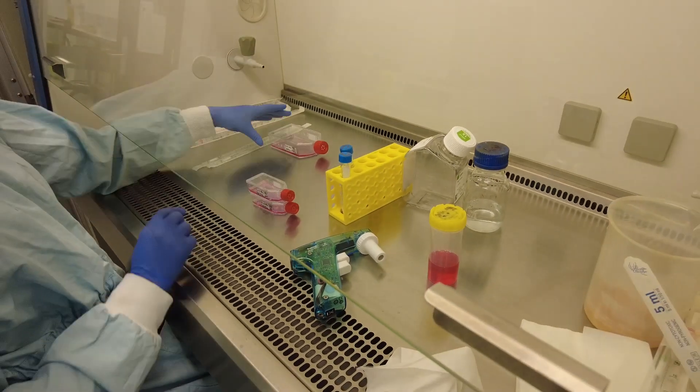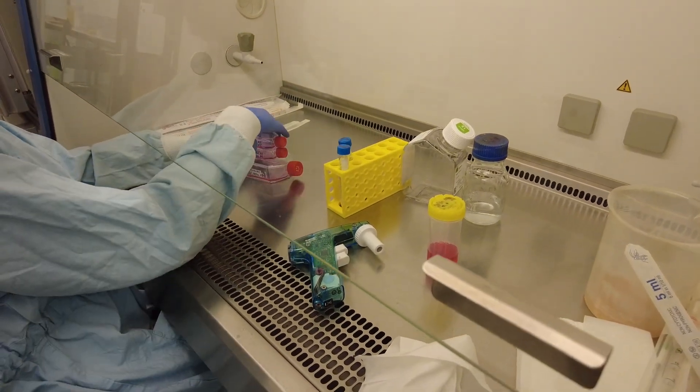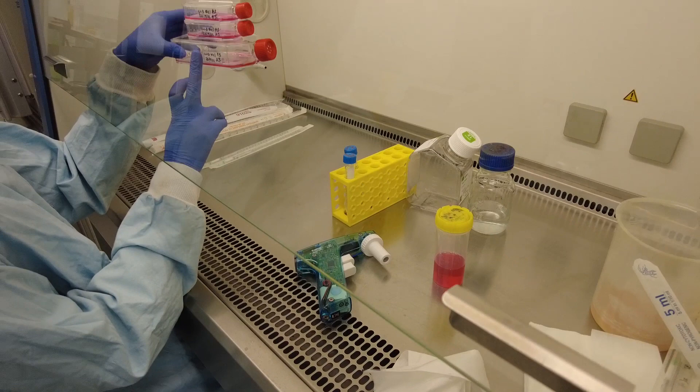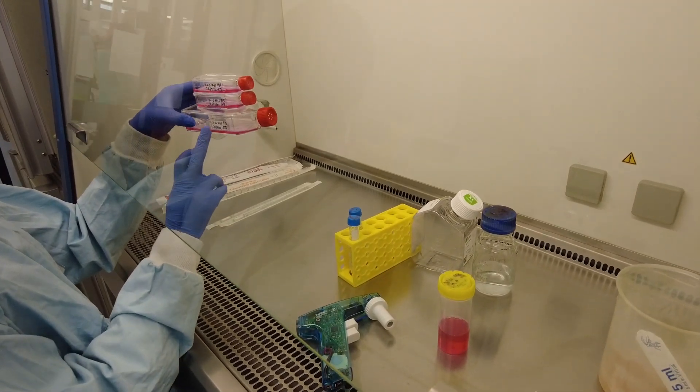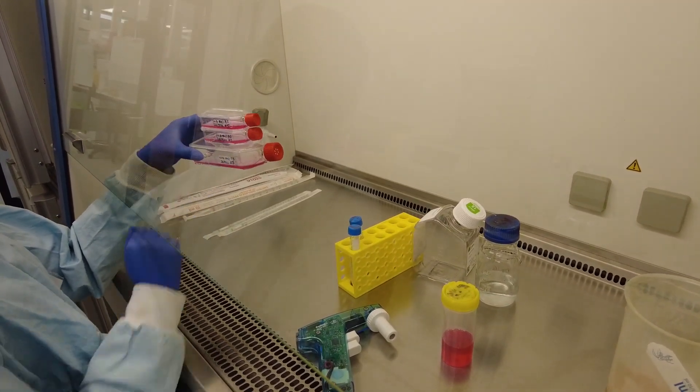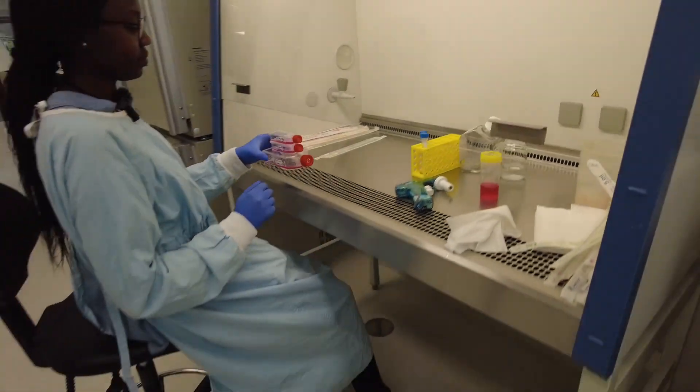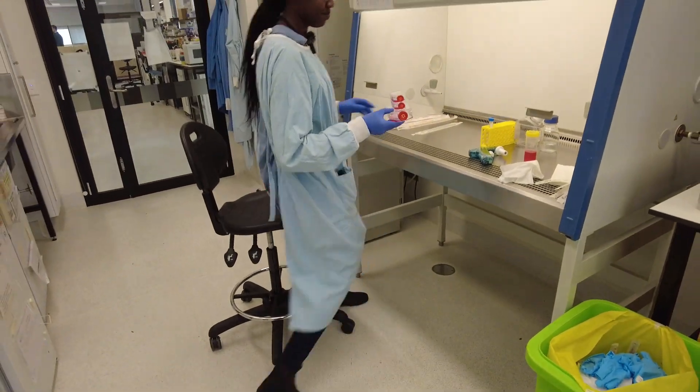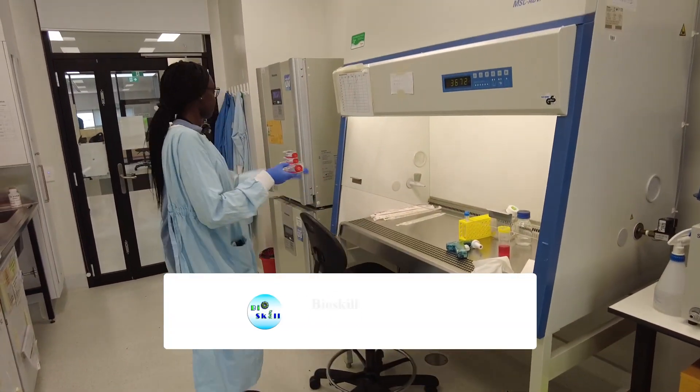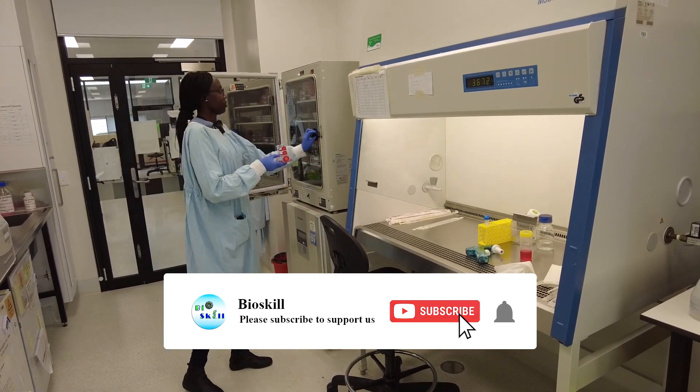Make sure it's covering the entire base. And now we've split our cells into three different flasks. And this Passage 3, we're going to leave it and put it into the incubator.